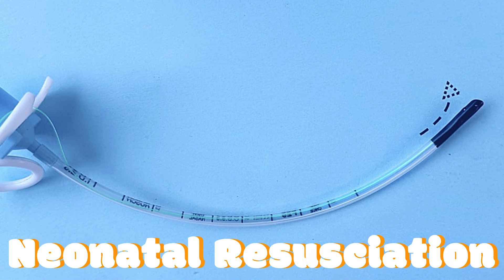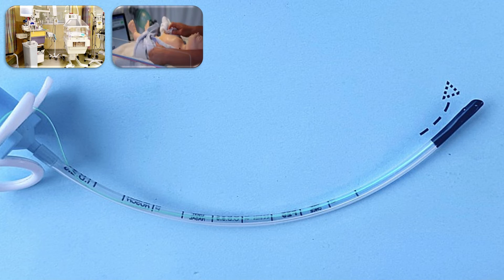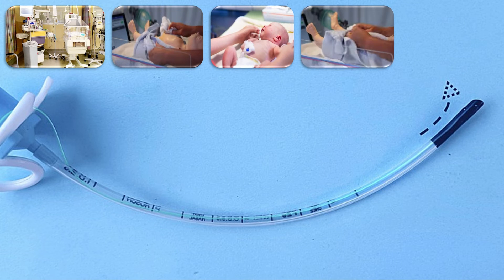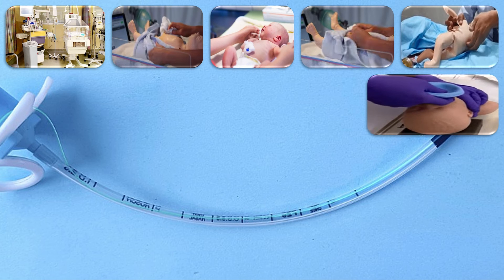First of all, make sure that the environment is neat, clean, and safe, and that the required equipment is ready. The baby should be received in a dry, warm wrapping sheet. Assess for color and breathing of the baby, then dry the baby with the sheet — very often during drying the baby starts breathing. If the baby doesn't start breathing with drying, stimulate the back of the baby and the soles of the feet. If still not breathing, start suctioning of the mouth and then the nose.